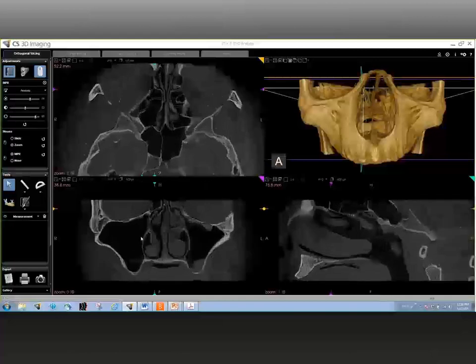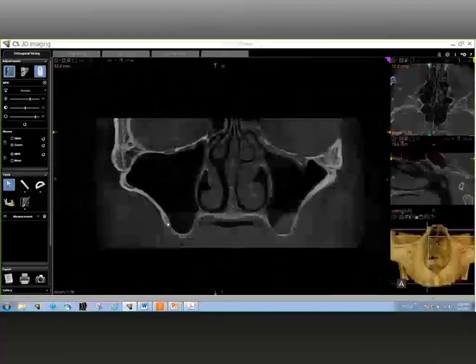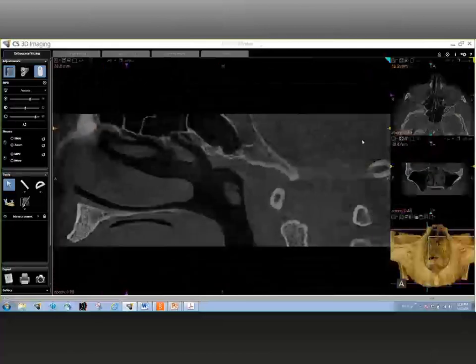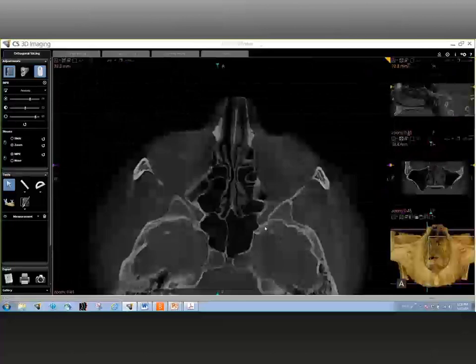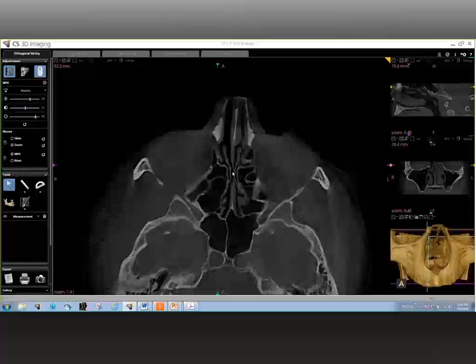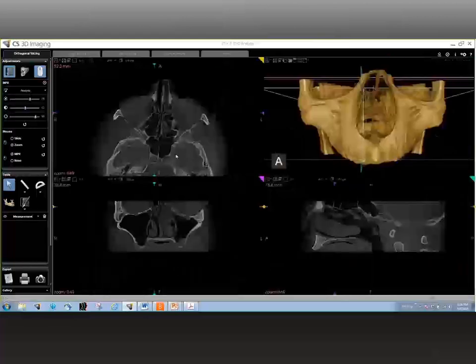If you look at the coronal view, you do see the maxillary sinus bilaterally — you have the right and the left side. Going to the axial view, what the arrows point out are those web-shaped structures, which is the ethmoid sinus — a little bit posterior and superior to the maxillary. And for the posterior area, where you can see the two large compartments, that is the sphenoid sinus, located in the sphenoid bone. They all form together the paranasal sinuses.